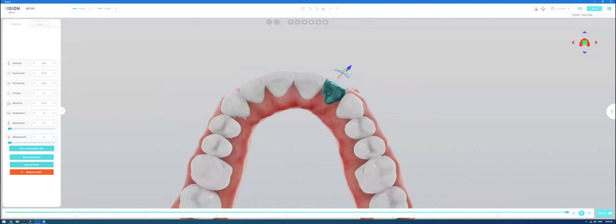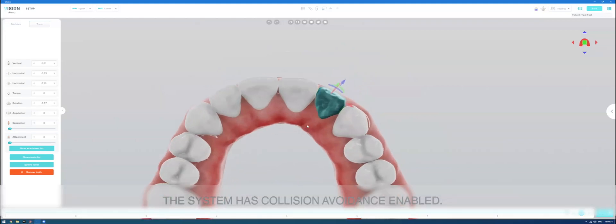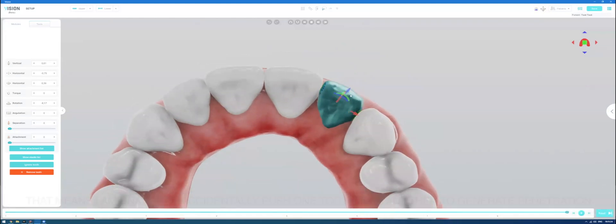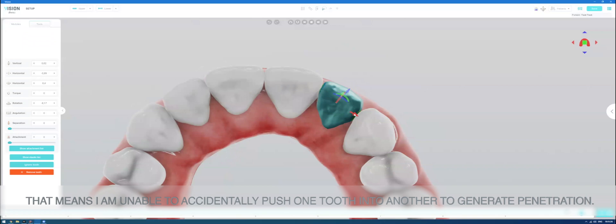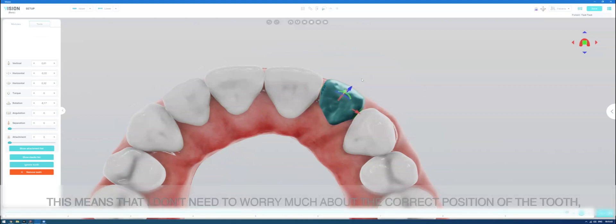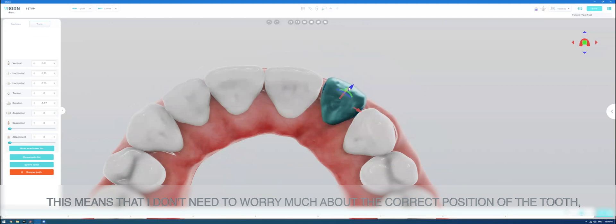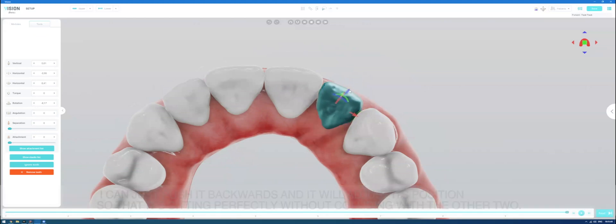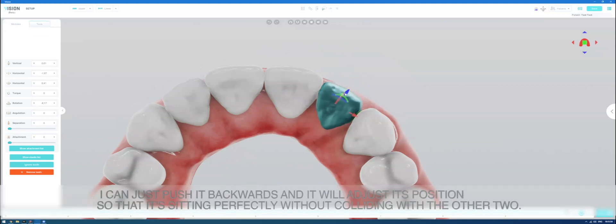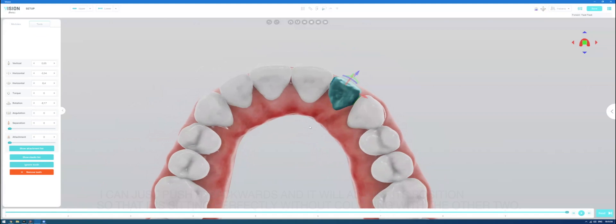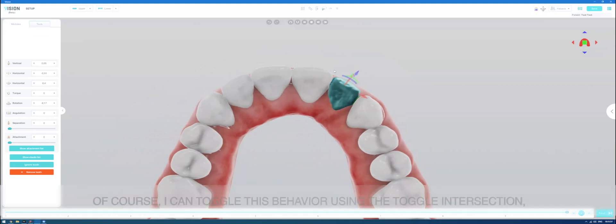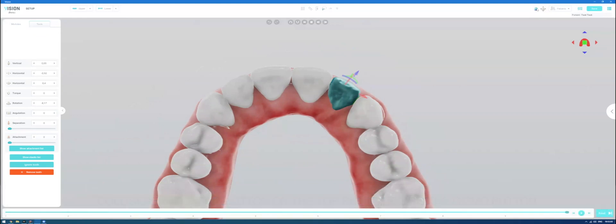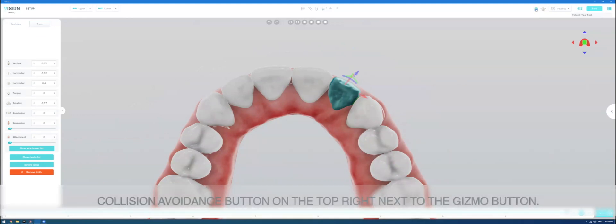So the system has collision avoidance enabled. That means I am unable to accidentally push one tooth into another to generate penetration. This means that I don't need to worry much about the correct position of the tooth. I can just push it backwards and it will adjust its position so that it's sitting perfectly without colliding with the other two. Of course, I can toggle this behavior using the toggle collision avoidance button on the top right next to the gizmo button.